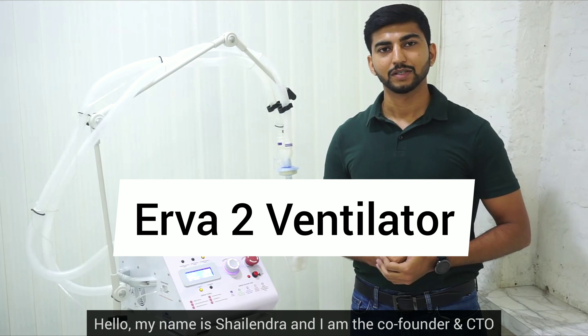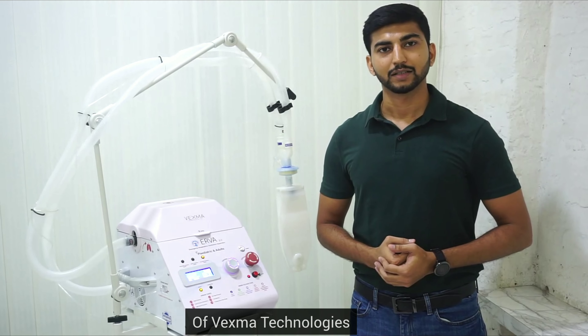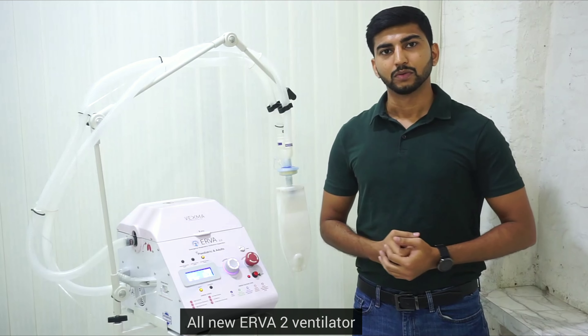Hello, my name is Shailendra and I am the co-founder and CTO of Vexma Technologies. Today I am going to give you a brief introduction to the all-new ERVA 2 Ventilator.